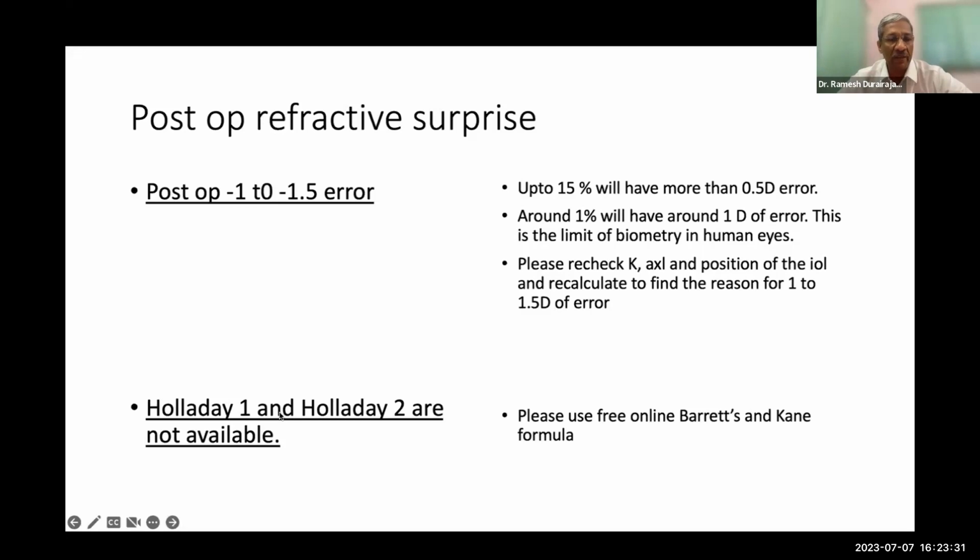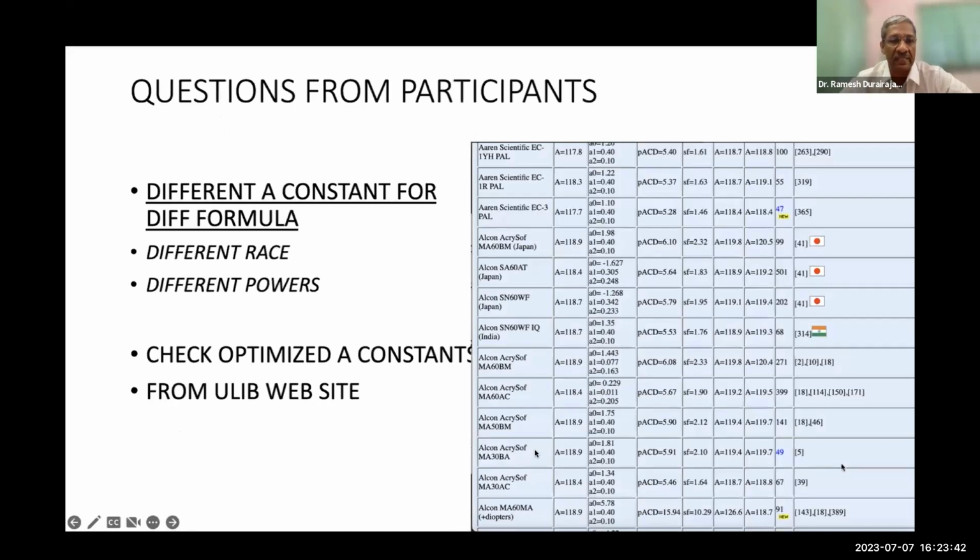What do I do? One more participant said, I don't have Holladay 1 or Holladay 2. They're not available. You are always welcome to use the online Barrett's. It is available to all of us who have a cell phone and an internet connection.